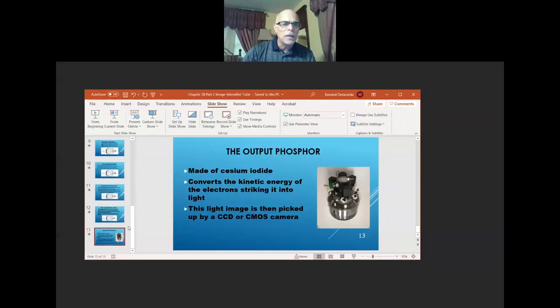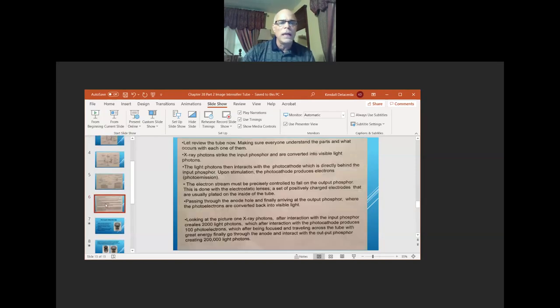And that was it, guys. Let me go back. I'm going to do that quick review for you right here. Let me read it to you. It says, let's review the tube now, making sure everyone understands the parts and what occurs with each one of them. X-ray photons strike the input phosphor, cesium iodide needle-like structures, and are converted into visible light photons. These light photons then interact with the photocathode.